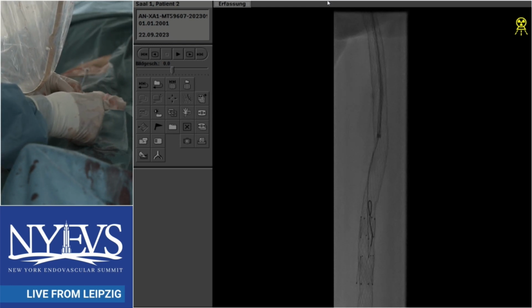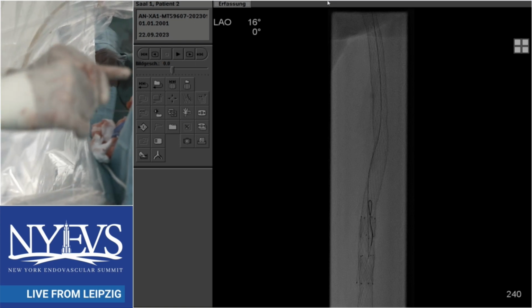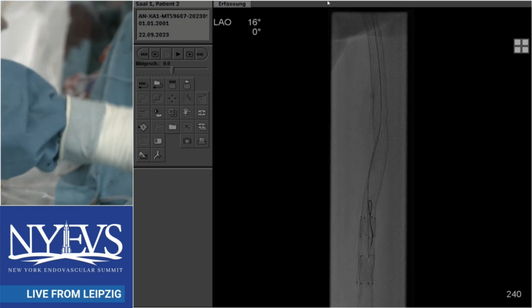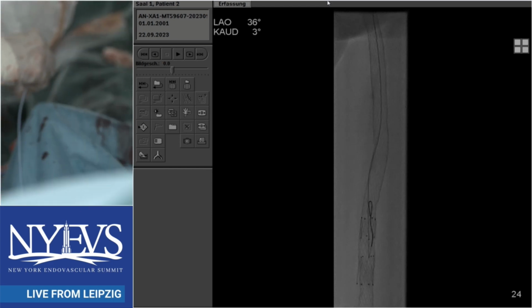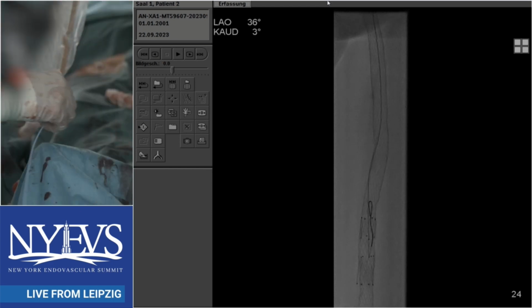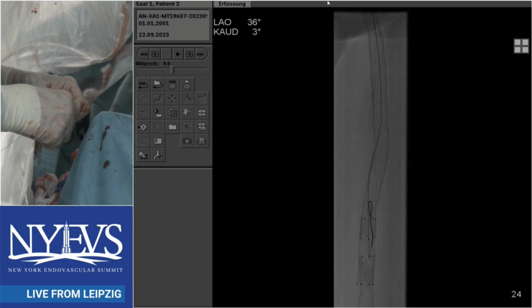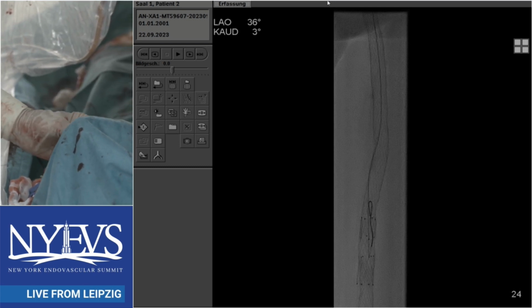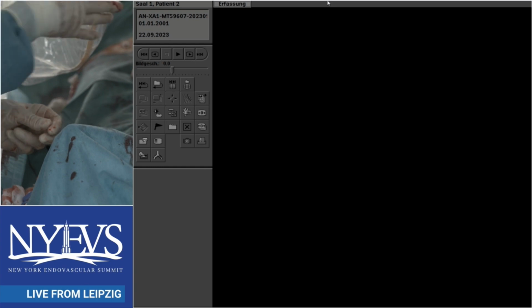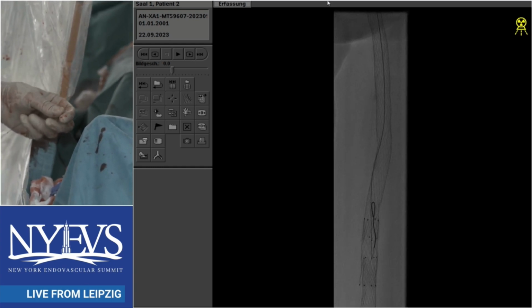Thank you for your case. I want to ask which catheter are you using for the retrograde there? Pacific 340. Which catheter are you using for the retrograde when you did your retrograde access? That was a very simple support catheter, QuickCross 035 short. What's your experience? You can take anything in. I mean, nothing bleeds here. You can take a sheath in, 6 French, maybe more, absolutely without risk.